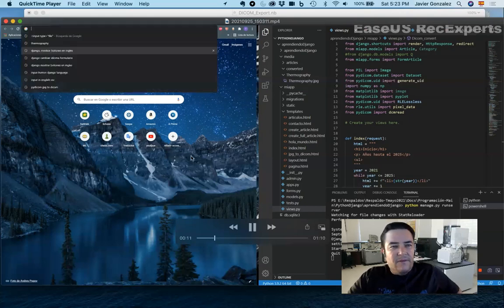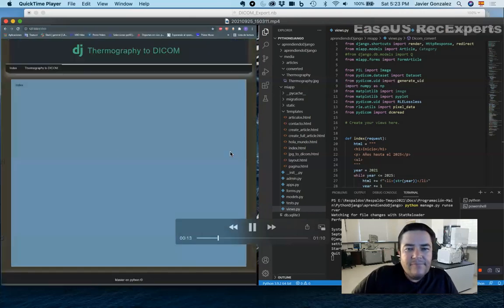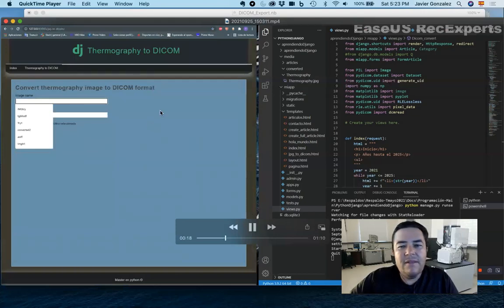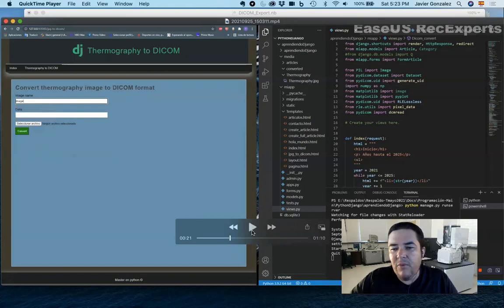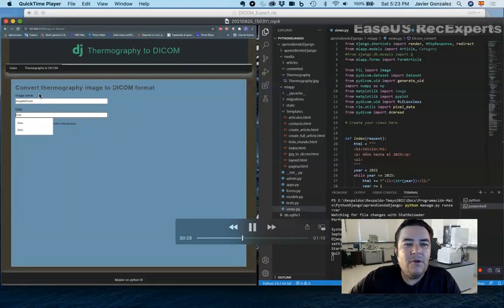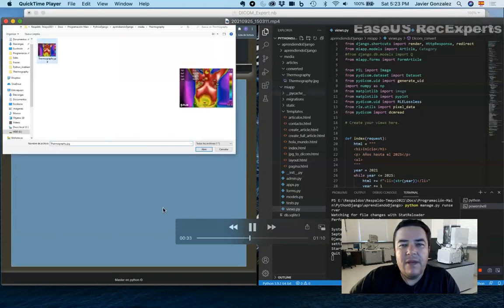So here it is. This is the graphical user interface based on the website using Django and the Python program, which I've already tested, that works exactly like the Mathematica code that I just showed you. It's just a user interface where you put the name of the thermography image and the output DICOM file, right?